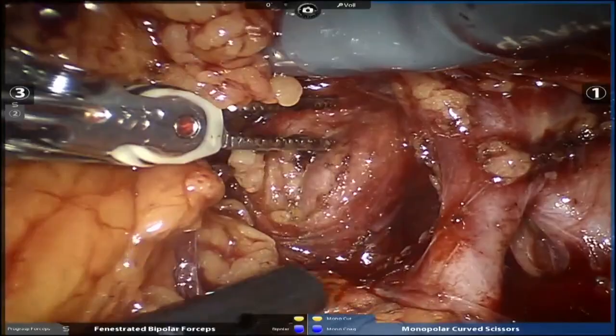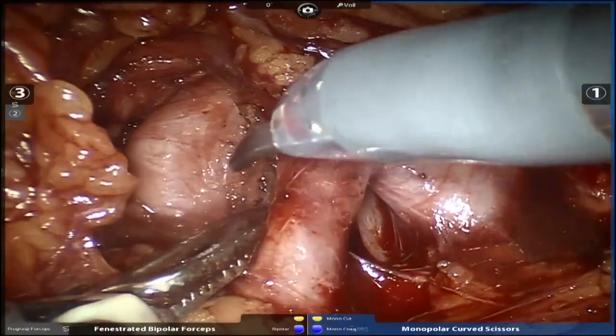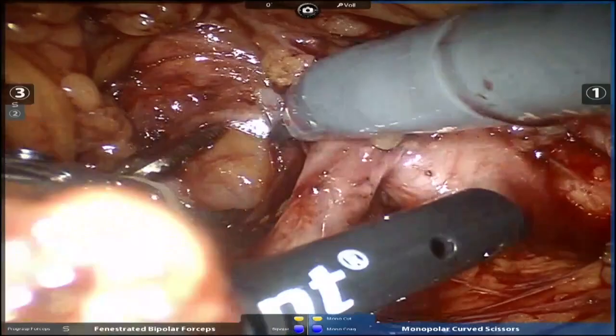And it's quite a big vessel anyway. This is not a little vessel. Had you not found that, it might have been an exciting case. It would have been basically an off-clamp case, is what it would have been. I would have called Dr. Gill to bail me out, because I don't do those.